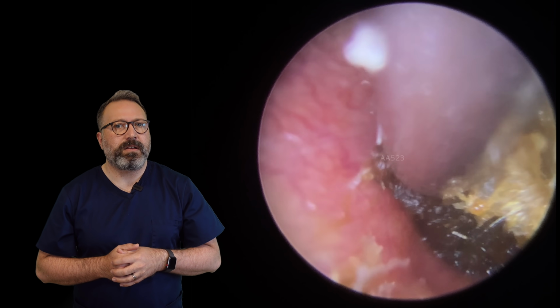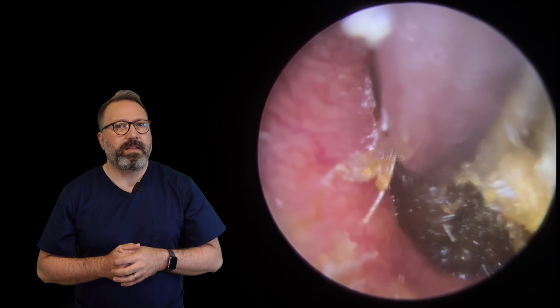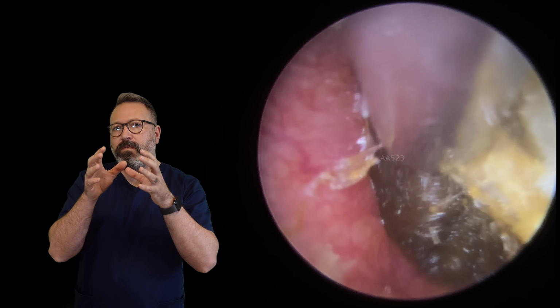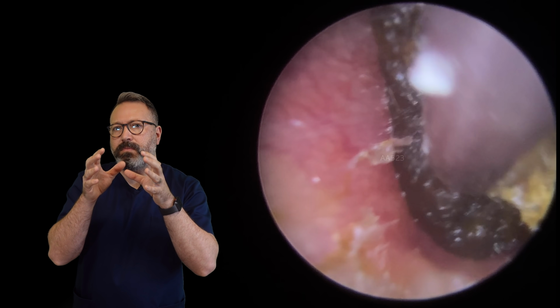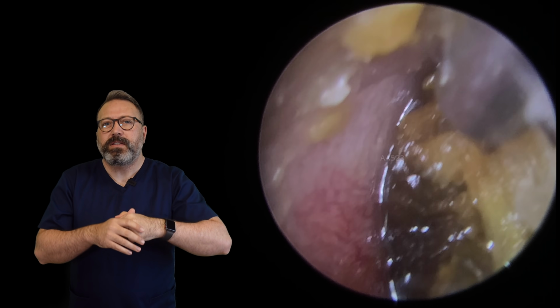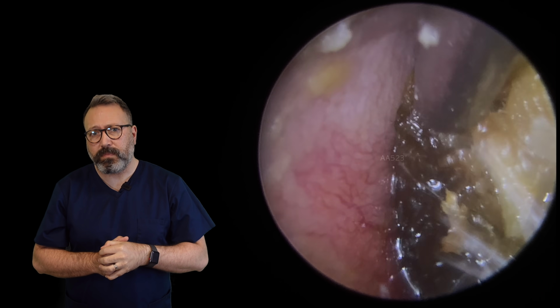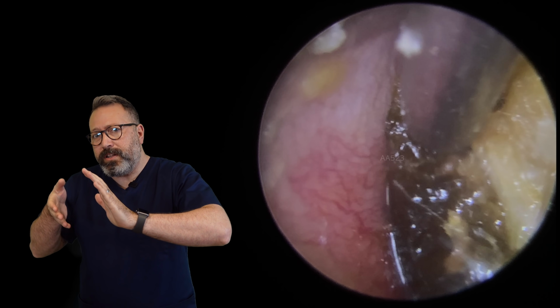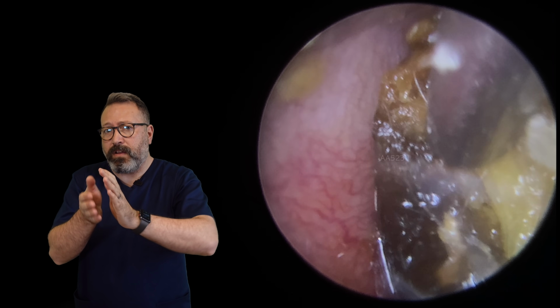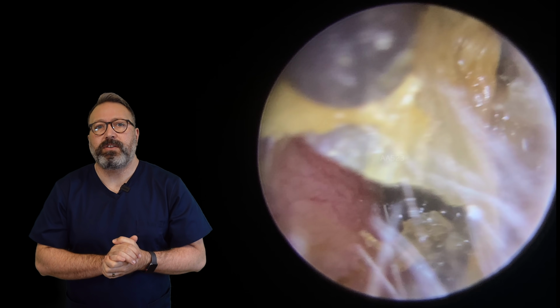Let's work on that harder section just there. If I can get a grip and do some very, very gentle wiggling, which is what you can see me doing here, sometimes it's just enough to draw the plug down. To give it a bit of a helping hand, we've introduced a little bit of olive oil in here as well. So if we do get this moving, that oil is going to work down the side of that wax and form a lovely slippery barrier, if you like. So it's just going to slide across that skin really well.